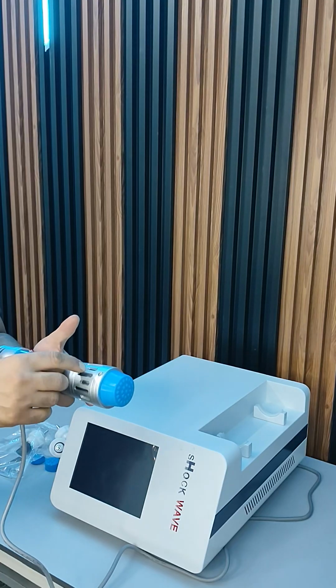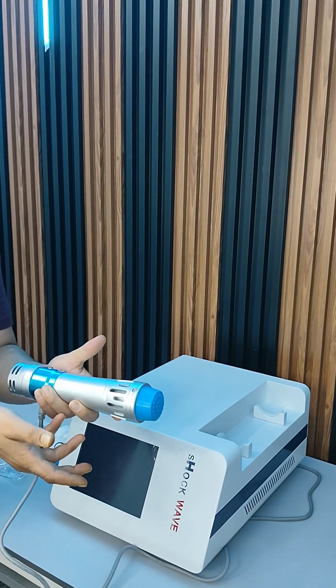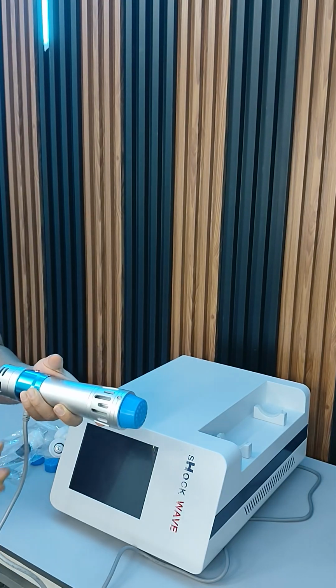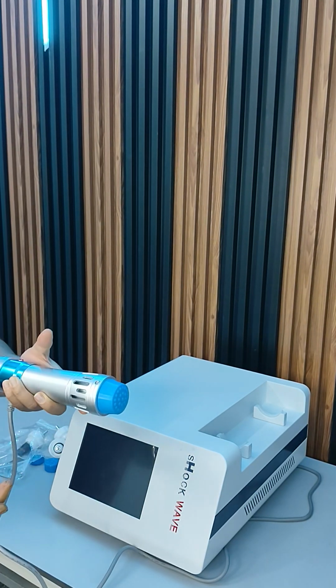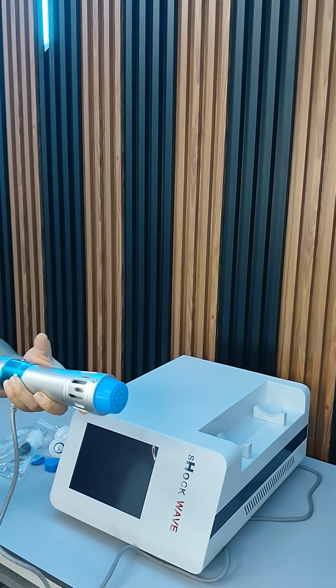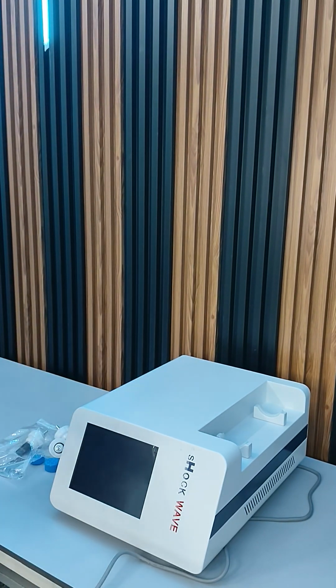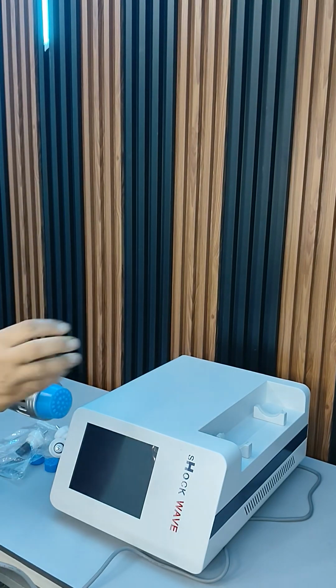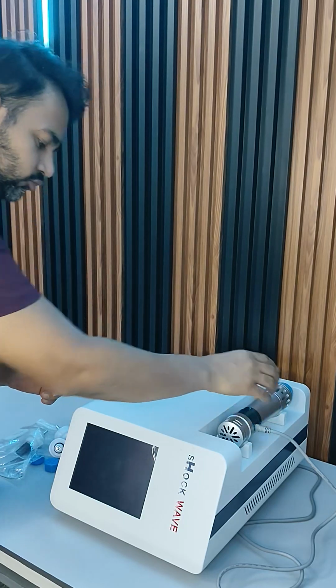If the travel of the bullet is because of the electromagnetic field around the bullet, that device is called an electromagnetic shock wave. And if the bullet travels because of some force from behind, like air compression, that device is called pneumatic or air compression based shock wave therapy. So this is the electromagnetic one, where the electromagnetic field is there and the bullet travels from one end to another. So I will give you the demo of the device also.